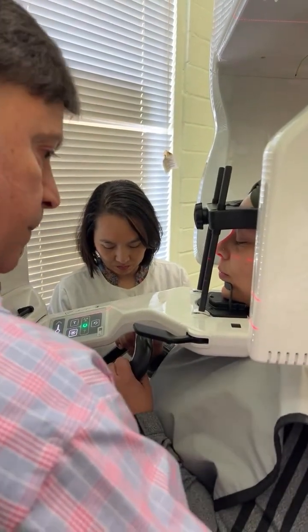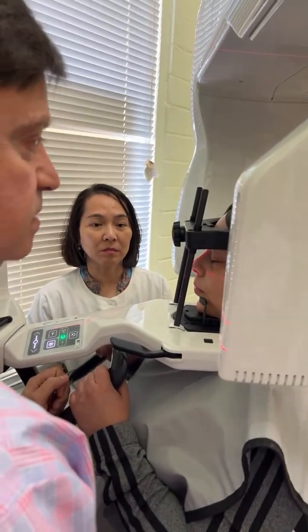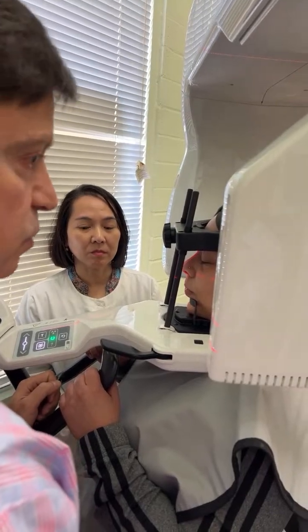So is it better just to have patients sit down? Most of the time, you can sit them down. But for a high-res scan, 20 seconds, and they're sitting in there for that long, sure, you can sit them down.